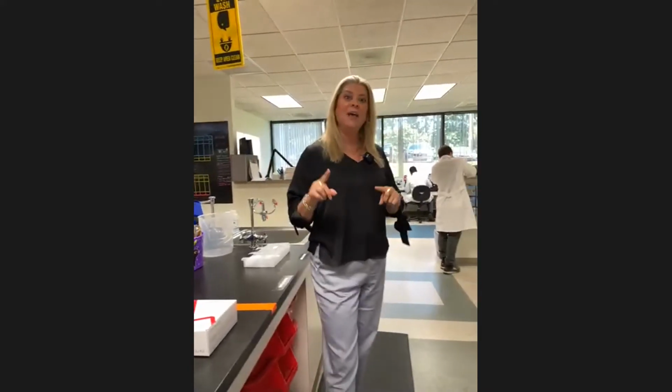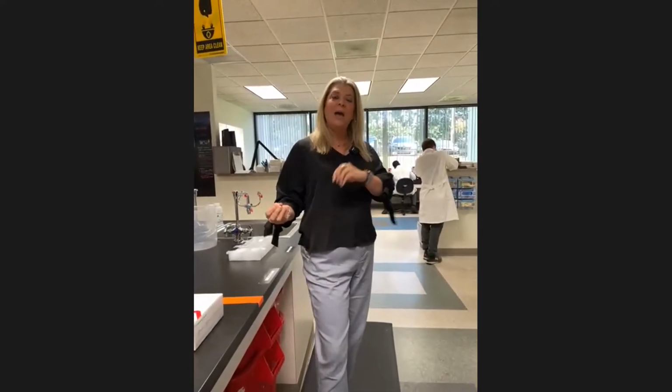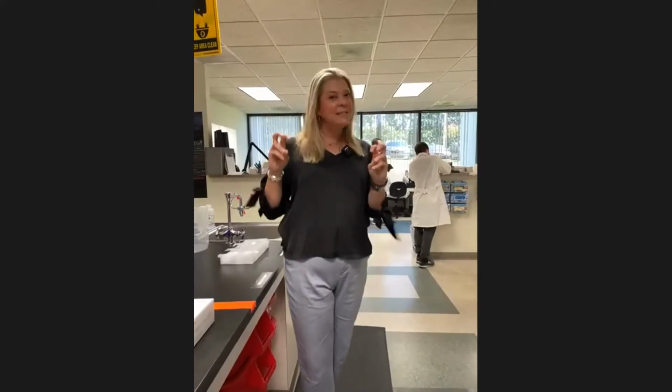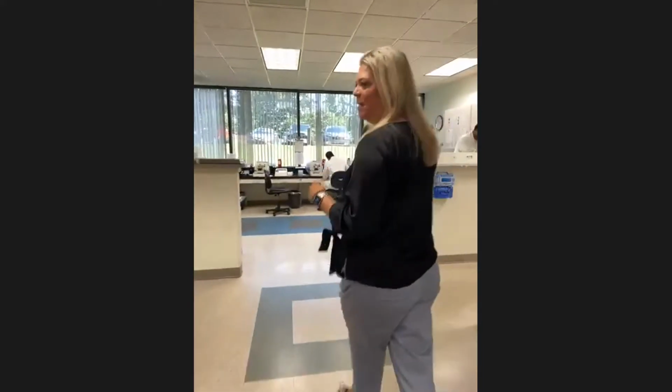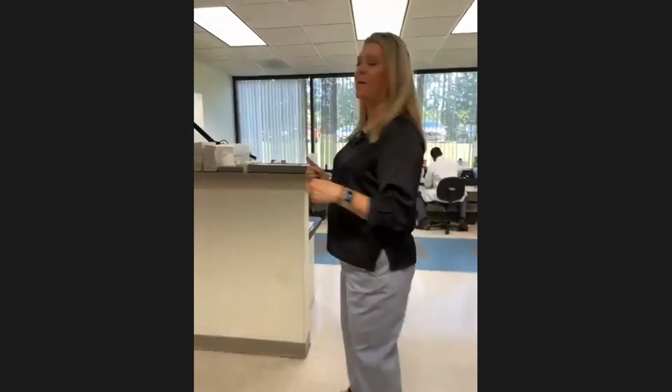And like John mentioned, from there, we take a piece of that tissue and we move it over to the first test that we do on the tissue. It's something called light microscopy. So we're going to run over here to the light microscopy area and see what happens there.